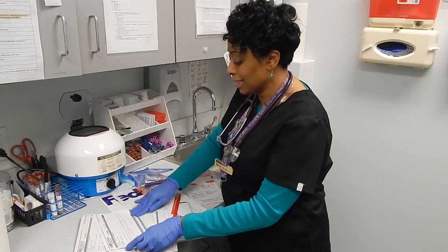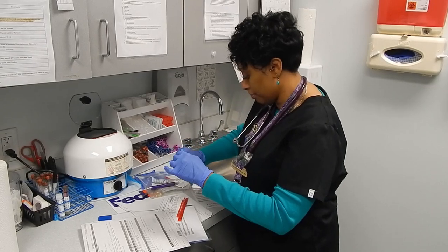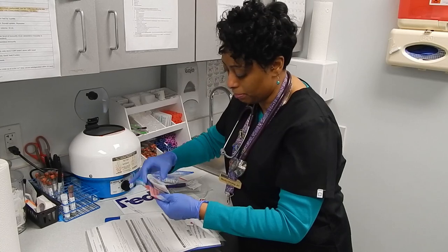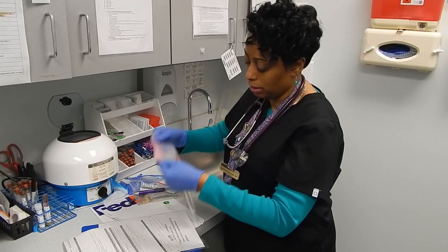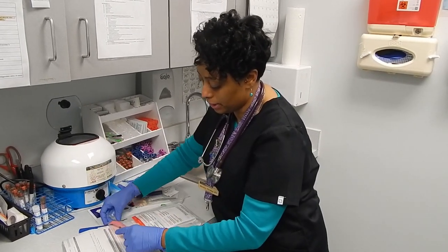This is going to be sent out today via FedEx. What we do is we keep it sealed in our lab until the FedEx courier picks it up later on this afternoon, and it's going to be sent to California. The results should be back to your company within three to five days.